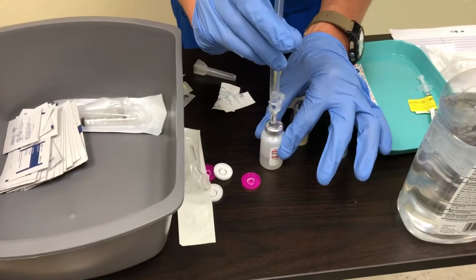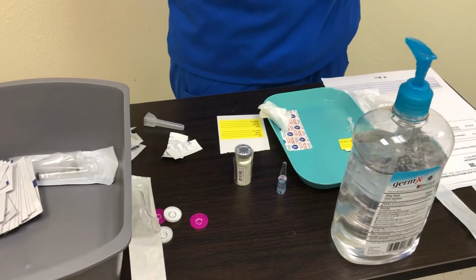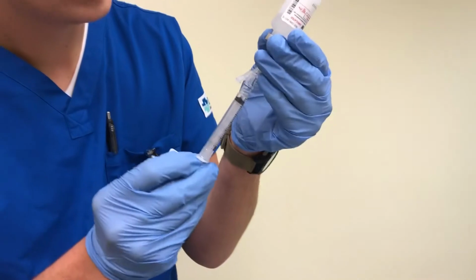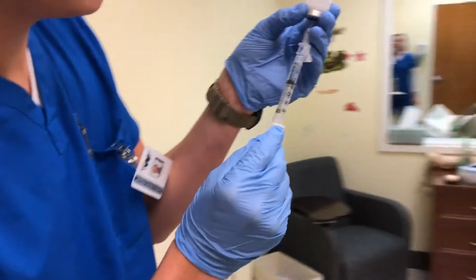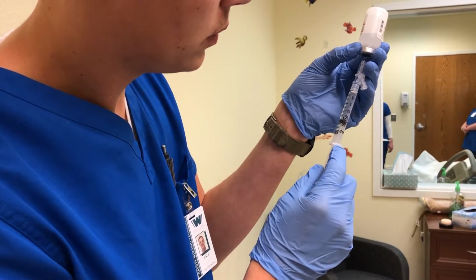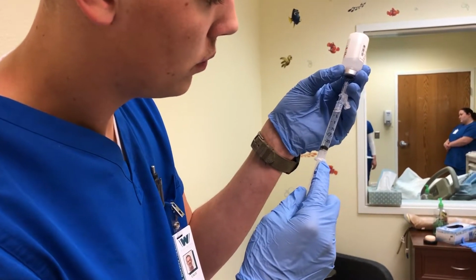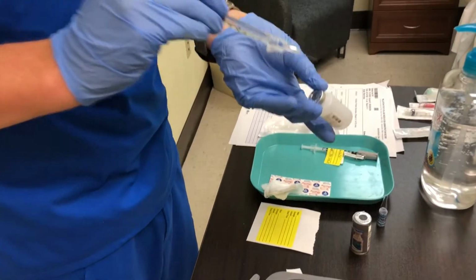And that's going to go into the sterile water. And we're going to invert and pull 3 mils of water out again. And then we're at 3 mils at eye level, so I can invert and pull the needle out.